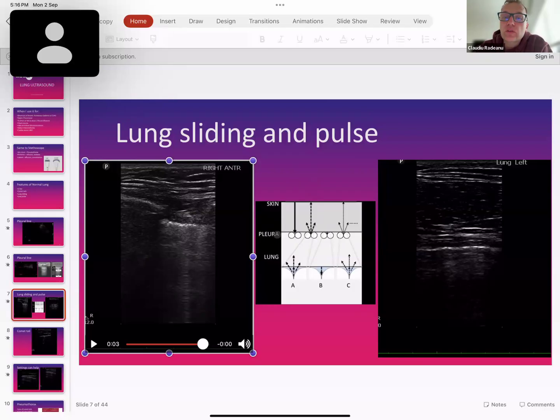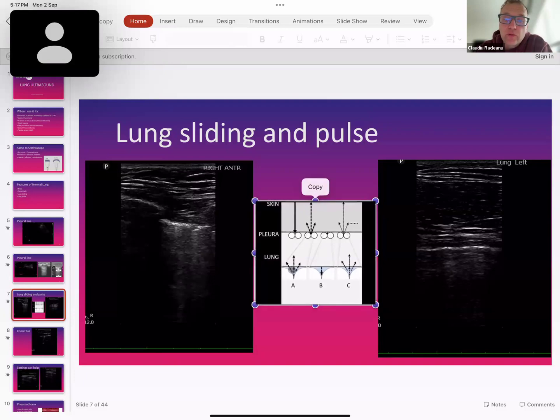This is a virtual space. The pleural space is not so big. It's actually very tiny. But underneath the visceral pleura, you'll have a little bit of alveoli and a little bit of air, a little bit of fluid in between alveoli. And therefore, this reflects in such a way that it gives you this kind of artifact. Okay, so these comet tails are actually also part of the normal lung, and it shows that you would have normal alveoli underneath it. Okay.